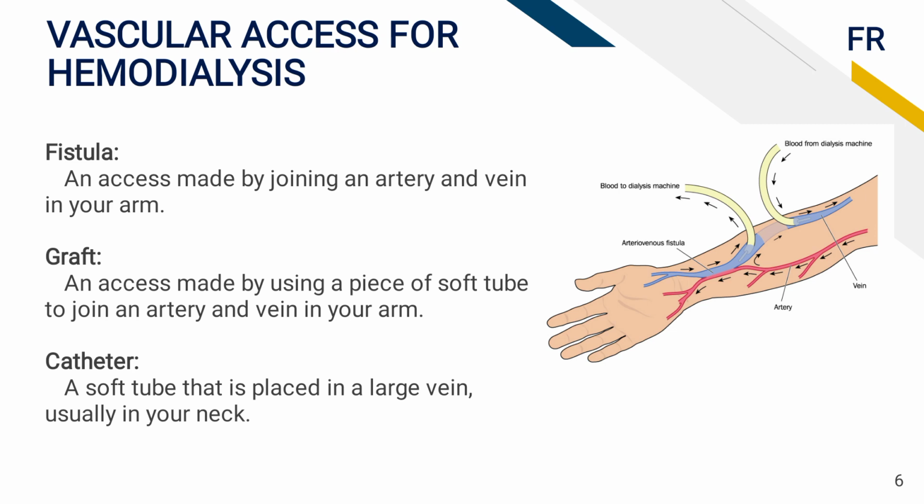So why do you need to place a tube in the neck? In the sense, some people have to undergo dialysis daily. So at the time of inserting a needle into your vein in the arm, taking it out and again inserting it would also cause you some infections, right?